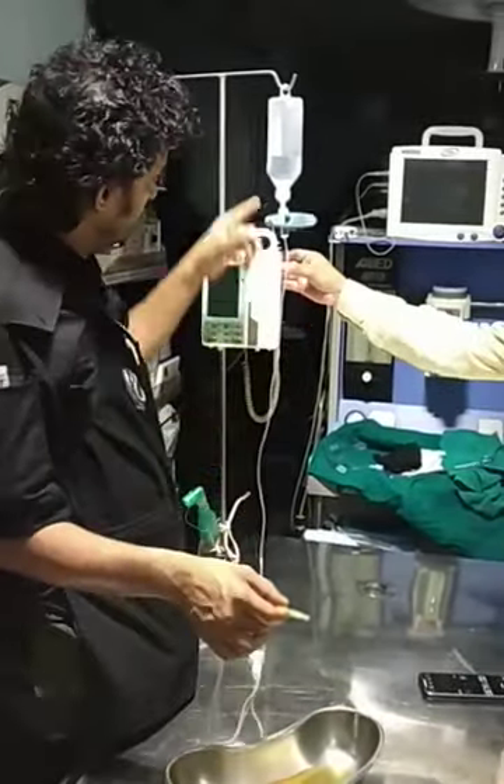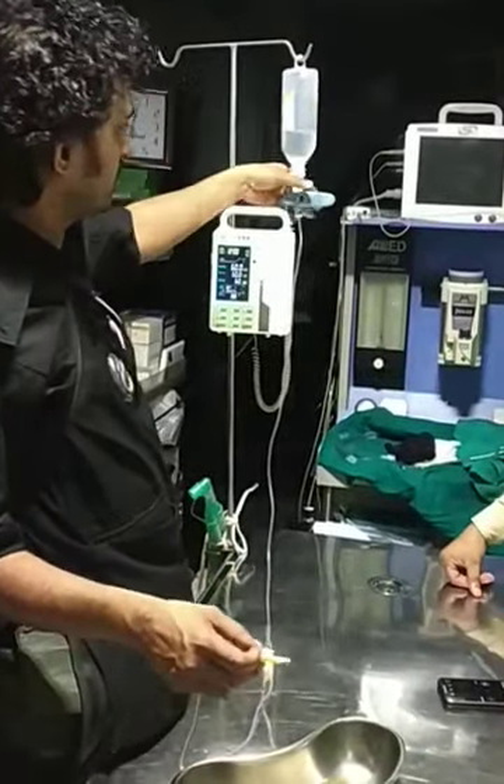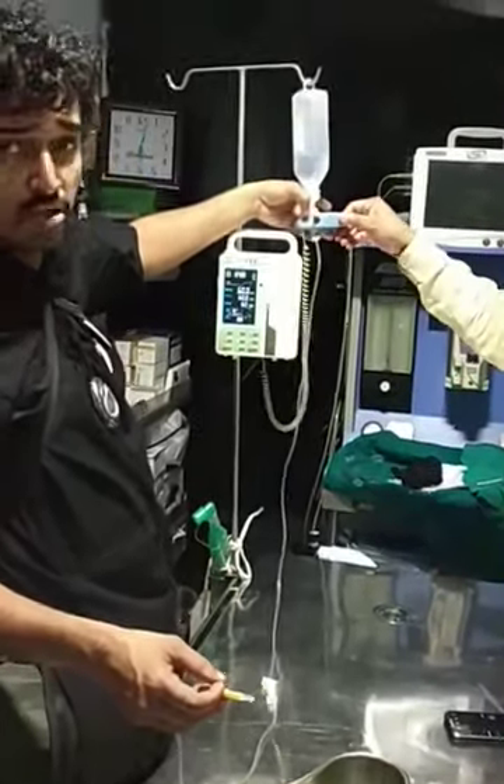An ordinary giving set can be connected to the infusion pump. There is a button on the back like this, as you have just seen. Now this is the provision where you control the number of drops per minute.